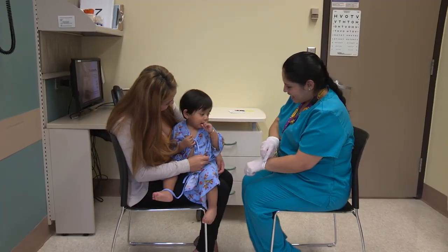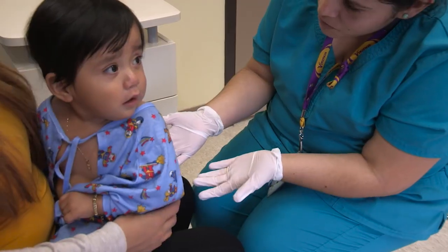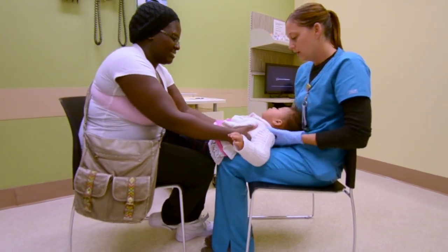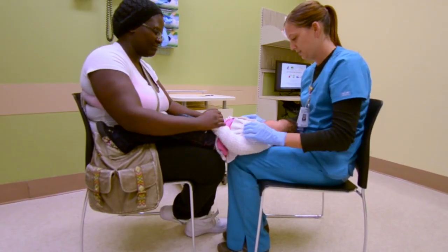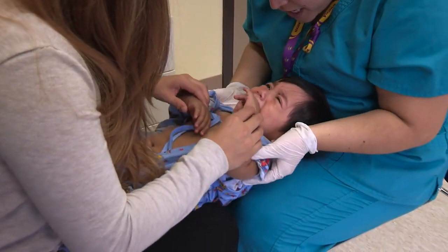For infants and toddlers, the knee-to-knee position is very effective. The parent or caregiver holds the child facing her with the child's knees at either side of their waist. The child's head rests on your lap, and the parent or caregiver can gently hold the child's arms. If the child cries, as many will, this will actually help open the mouth.